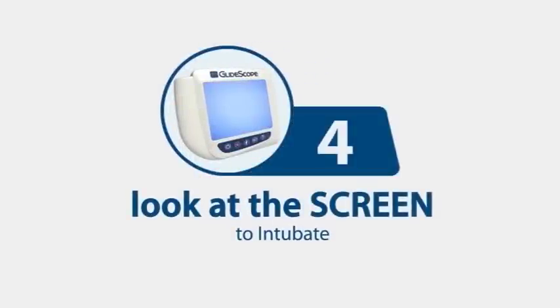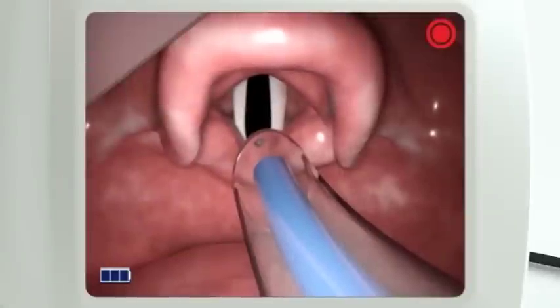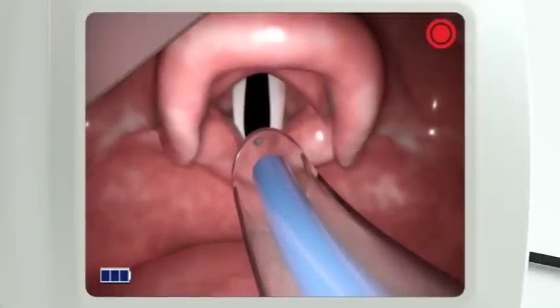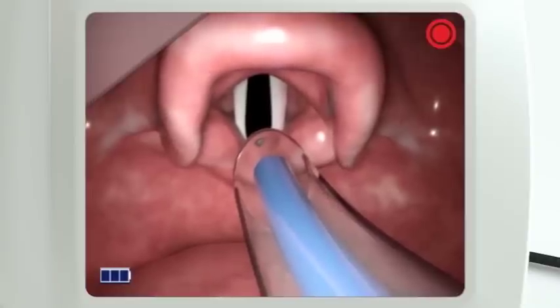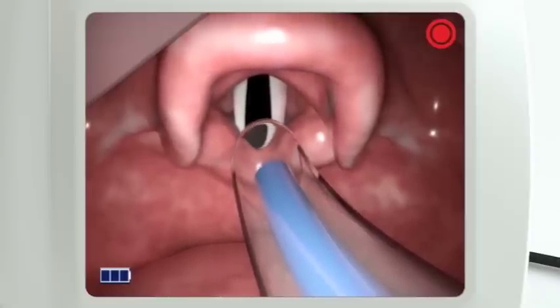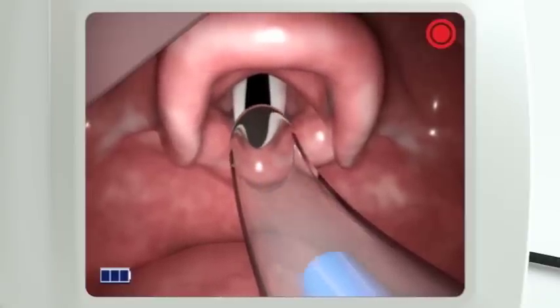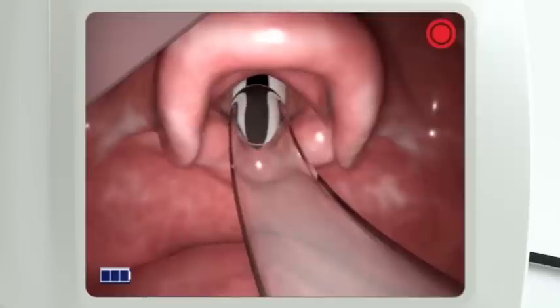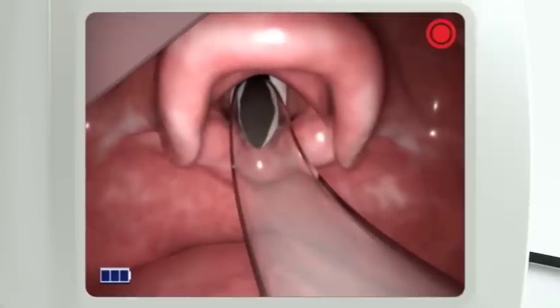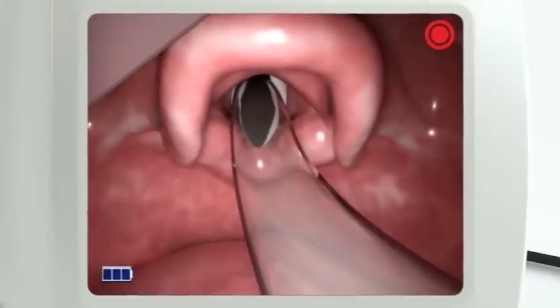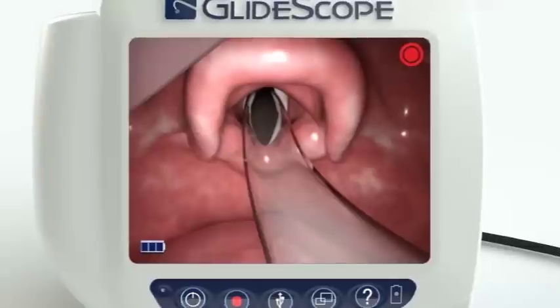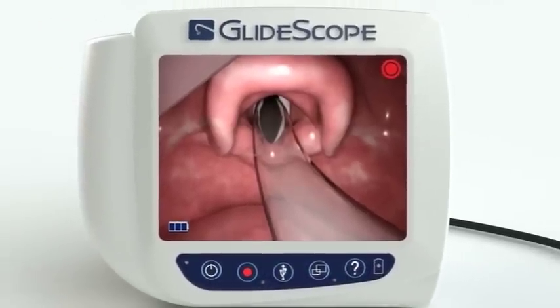In Step 4, focus on the video monitor as you advance the endotracheal tube. Returning your eyes to the video monitor gives you a view of the glottic aperture and near it, the tip of the endotracheal tube. The tube is then advanced by gradually withdrawing the stylet 2 to 3 centimeters as the tube moves forward. Viewing the entire insertion step on the video monitor allows you to quickly and gently rotate or angle the tube, using the right hand to redirect as needed.